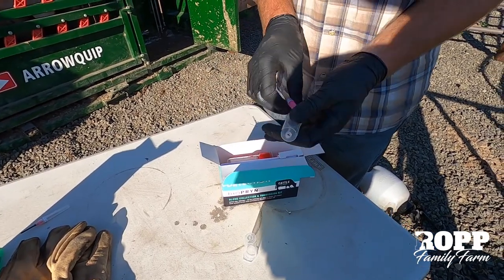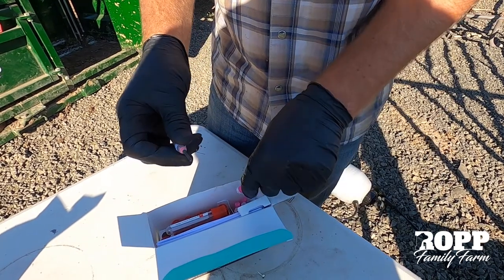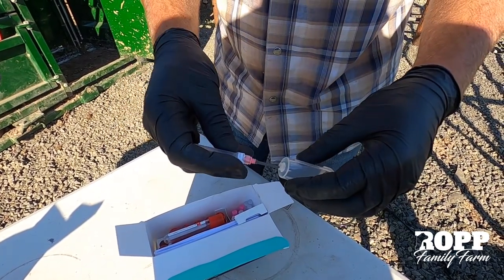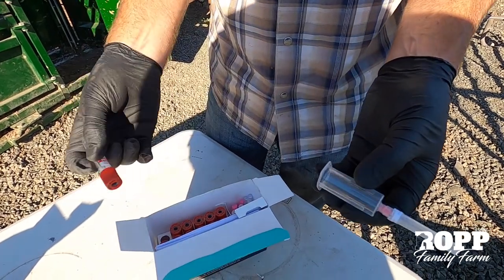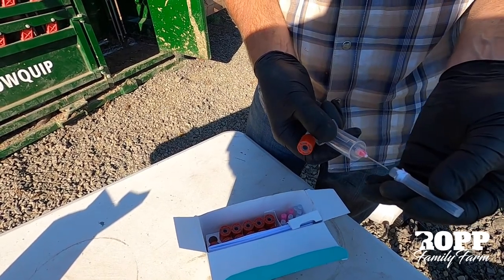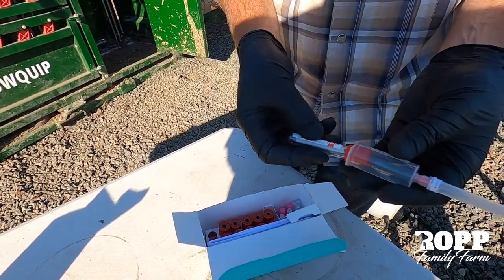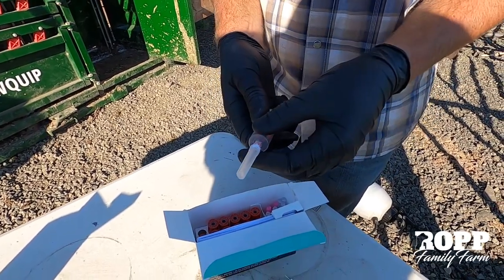To get this ready, all we've got to do is pop off the small end of the needle that's going to thread into the top. Then when we go in, we'll stick this needle into the tail head of the cow, have this ready, pop it on there, and that will start drawing blood since it's vacuumed.